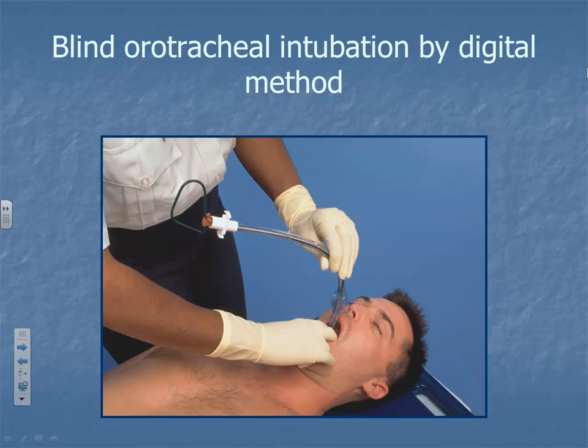So we're basically using what kind of blade here? We're lifting up the epiglottis. It's going to be the Miller. So we're using your finger like a Miller blade. You're going to lift that up. Now I've also got this finger out, right? So what we're doing here, too, without a stylet, that's fine. You're inserting this after you've got the epiglottis. I'm holding the epiglottis right here.